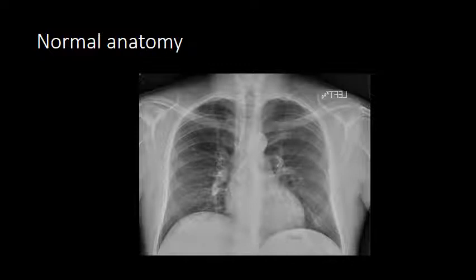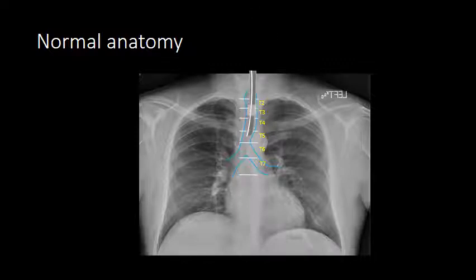When we look at the normal anatomy on a chest radiograph, here we see the outline of the trachea. We can see the vertebral bodies in the background, and the carina occurs right at the T6–T7 disc space in this person. With the endotracheal tube in place, we have a 5 centimeter distance between the carina and the tube tip.